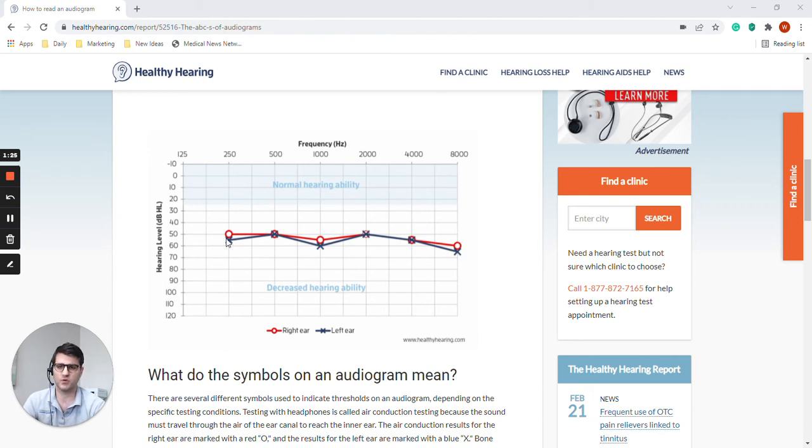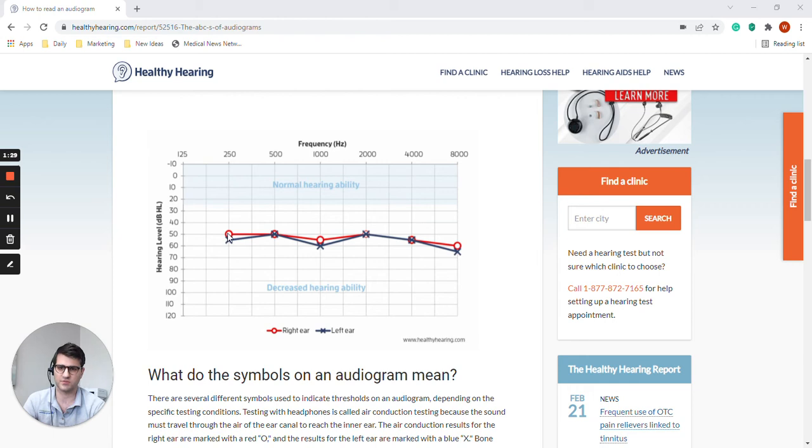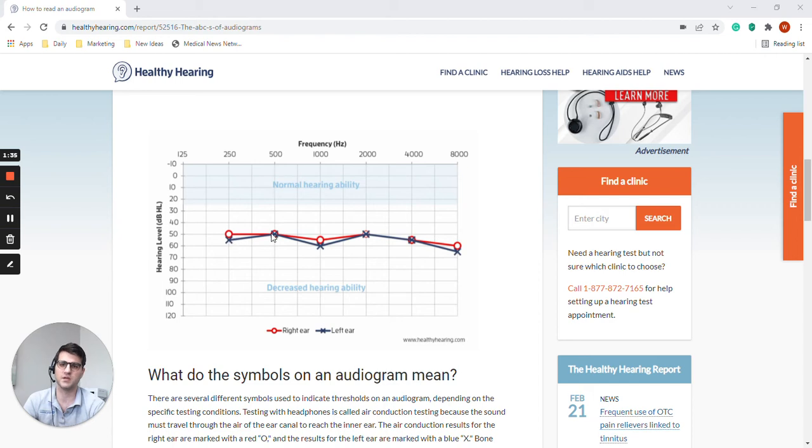So pure tone meaning the test signal that was used was a pure tone. So for this ear, these are the results for the 250 hertz test tone. These are results for 500 and so on and so forth.